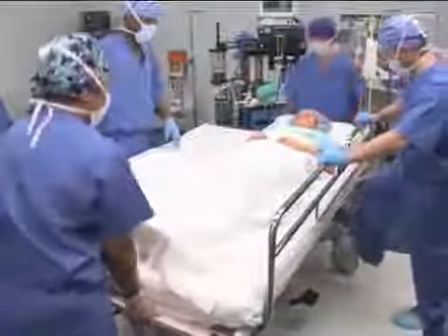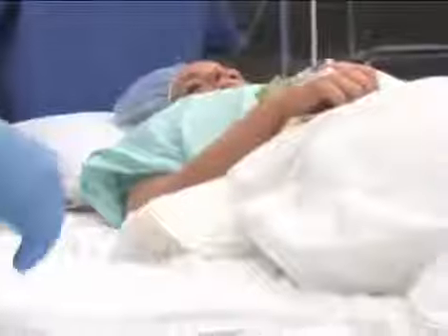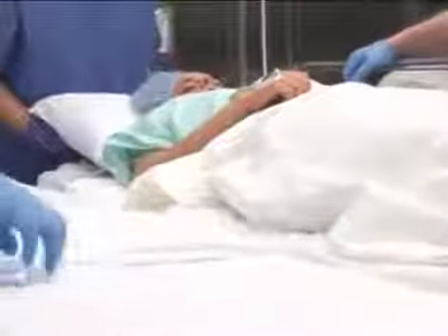Make sure the gurney's locked. It's locked. All right. Excellent. Before beginning the move, always tell the patient what you're going to do. We're going to move you over to the table, but don't do anything till we tell you to, okay?